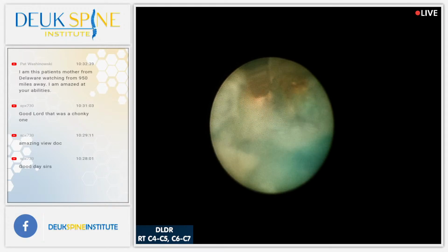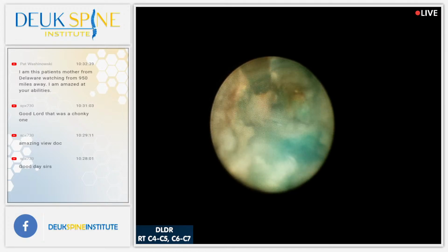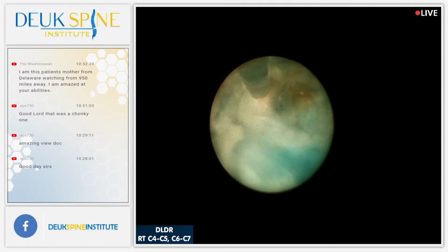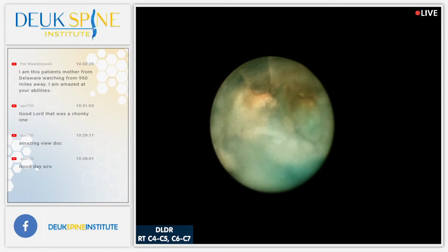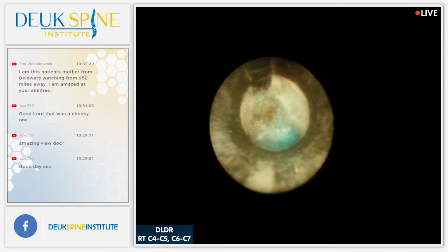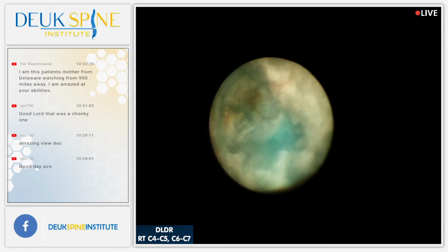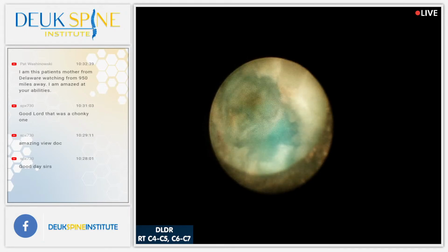And it looks huge to you and I because we're looking endoscopically. There's some inflammatory tissue. We're looking endoscopically, folks, and the endoscope magnifies this view. It makes it big. It looks big. Okay, get this. You see the sides of this tube? They're literally 2.5 millimeters apart. That's tiny.